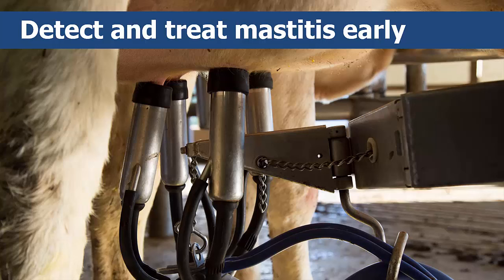Be sure to try to detect and treat Mastitis early. If you manage or operate a dairy farm and suspect one of your cows may have Mastitis, it's important to be able to correctly perform the CMT to appropriately care for and treat your cow. The sooner you treat, the sooner your cow can be healthy and safely producing milk again.